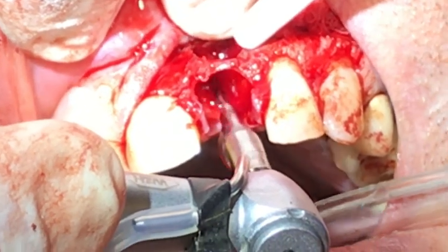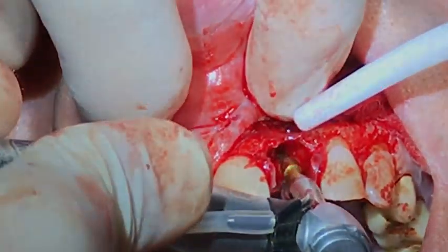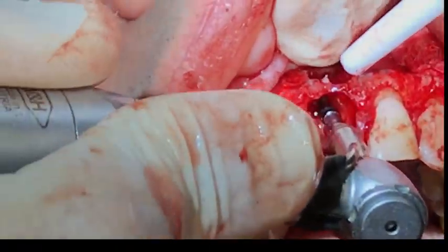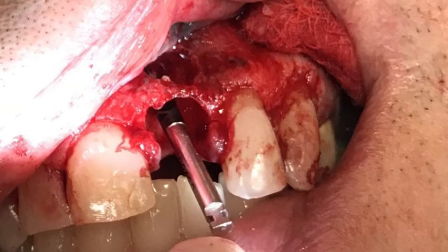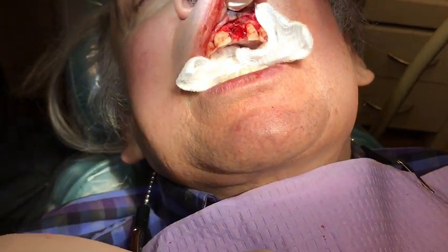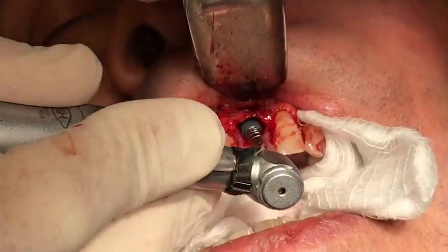Megagen drilling protocol was initiated with an emphasis on keeping the osteotomy palatal to the apical location. A drill was left in place to evaluate the opposing occlusion and make sure there was clearance for the implant. A Megagen Antiridge implant was picked up with the handpiece and placed into the osteotomy. The placement went smoothly and the implant was placed three millimeters apical to the adjacent CEJ.